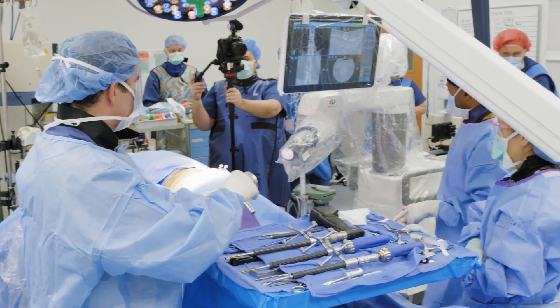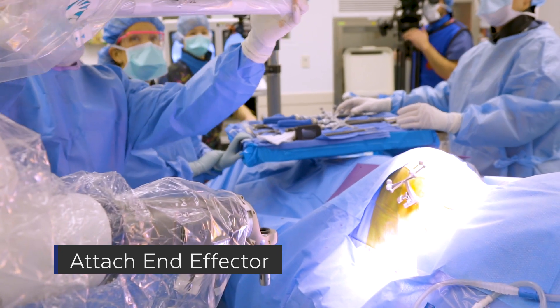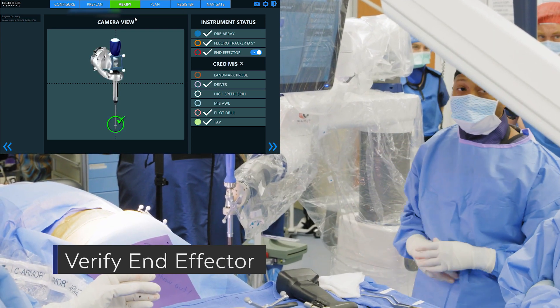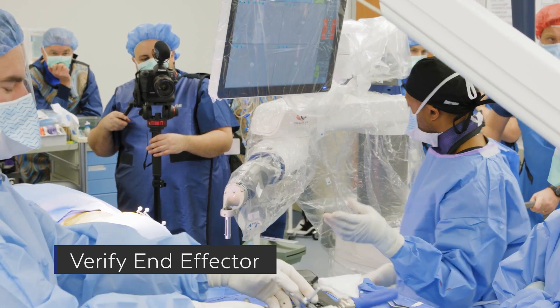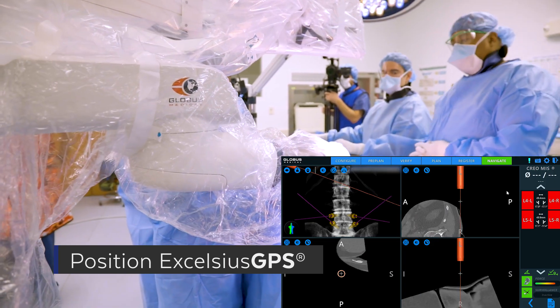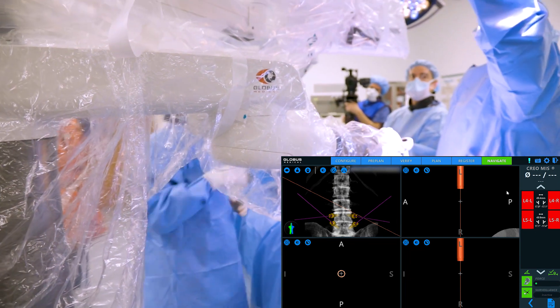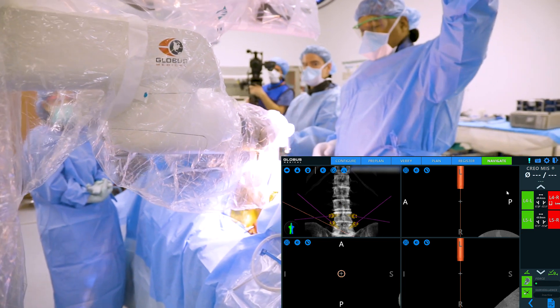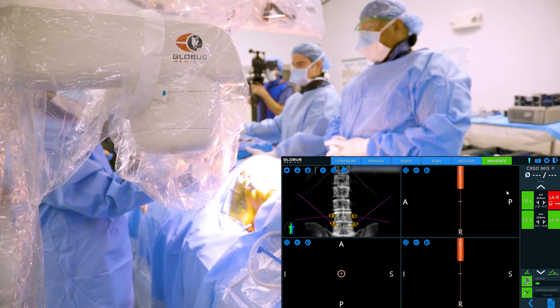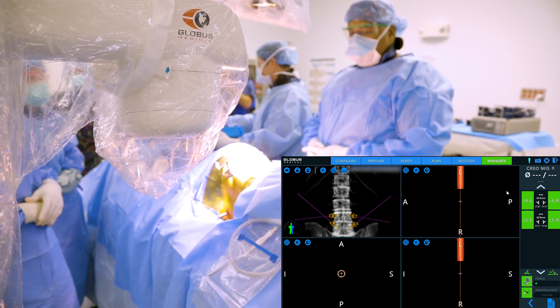First thing you're going to do is place the end effector onto the robot, then bring the robot in and make sure it's positioned. What we're looking for is that the red markers at L4 and L5 will turn to green — that will tell you that the robot will be able to place each of those screws in an accurate position. We may have to raise the table to get that last one, and there you can see we've raised the table and we're able to get all four of them green.